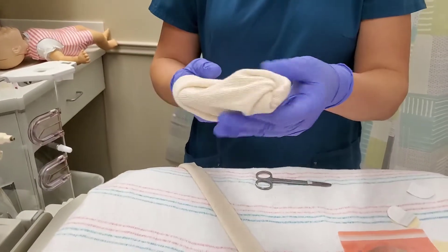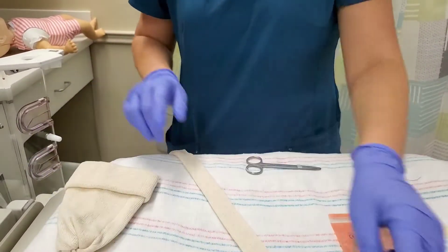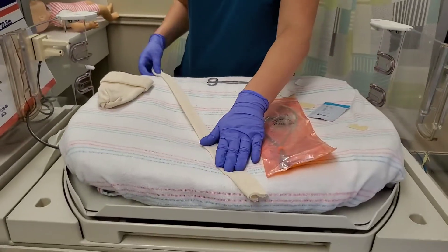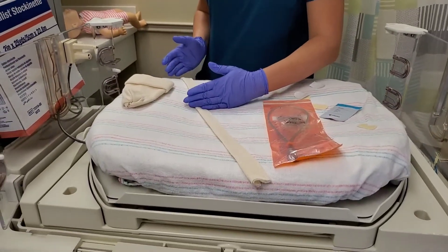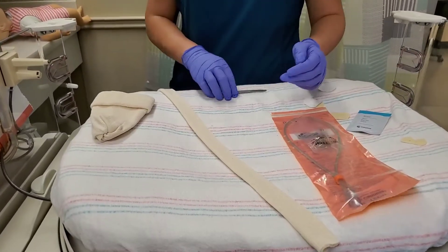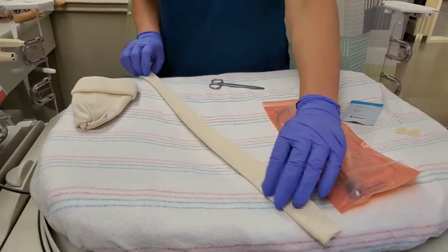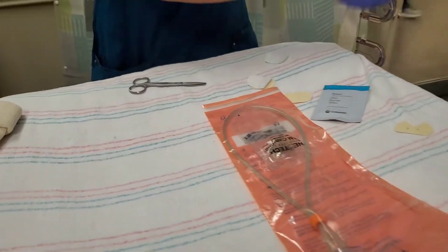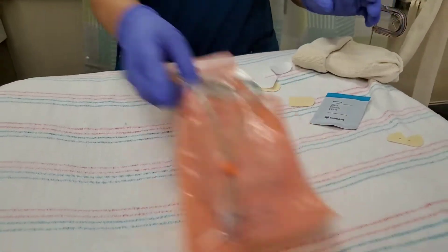We'll see if we got it right when we put it on the baby. For our chin strap, this is about the length I would want — of course much shorter for a smaller baby or micro preemie. I folded it in half, which provides a nice size for the baby's chin. Now that we have all our supplies, we're going to get our baby.